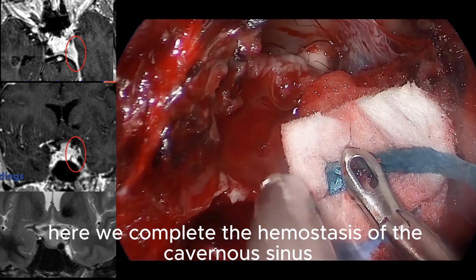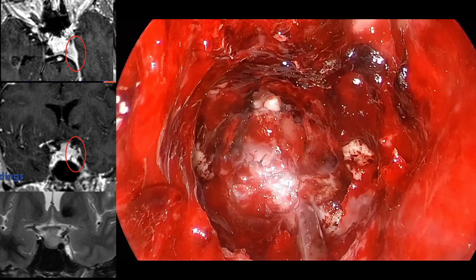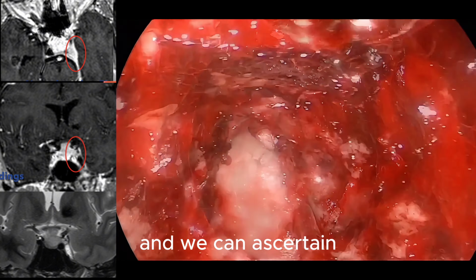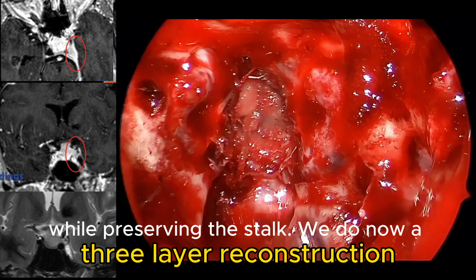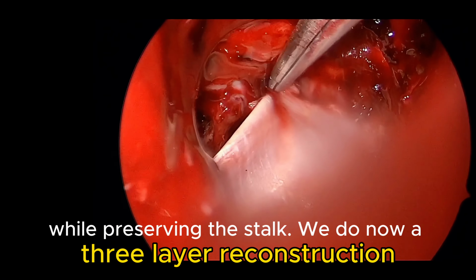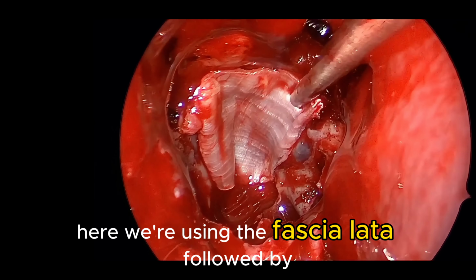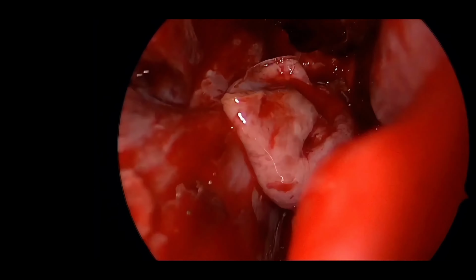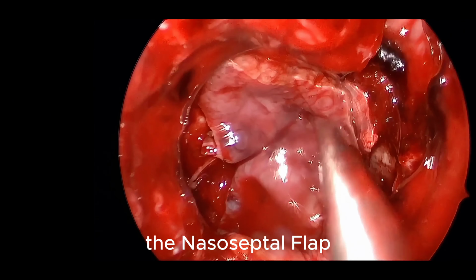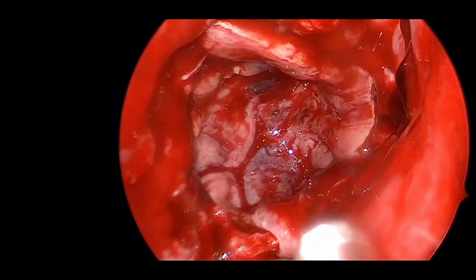Here we complete the hemostasis of the cavernous sinus. We can ascertain that we achieved a complete resection, preserving the stalk. We do a 3-layer reconstruction. Here we're using the fascia lata, followed by the nasoseptal graft that was peeled off by our colleague, Dr. Stavrides.